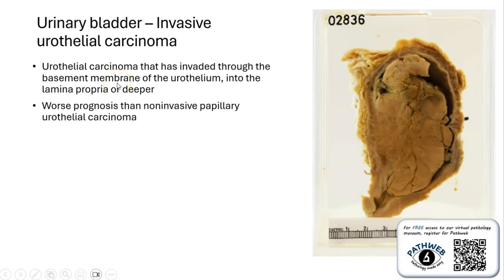So invasive urothelial carcinoma is defined as urothelial carcinoma that has invaded through the basement membrane of the urothelium into the underlying lamina propria or deeper. It has a worse prognosis than non-invasive papillary urothelial carcinoma.